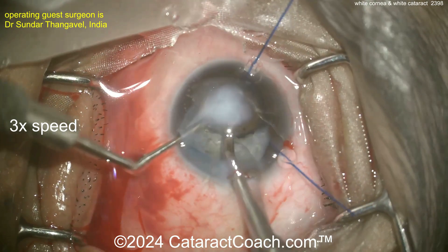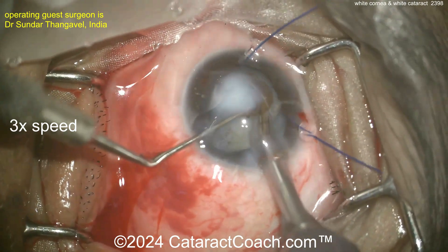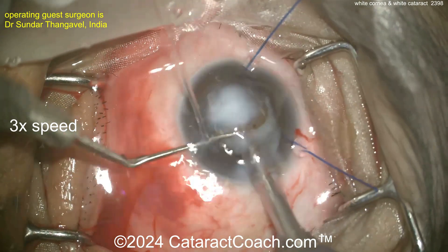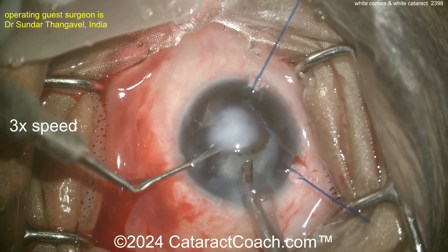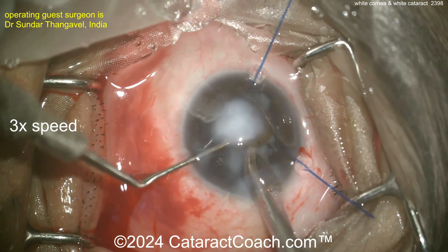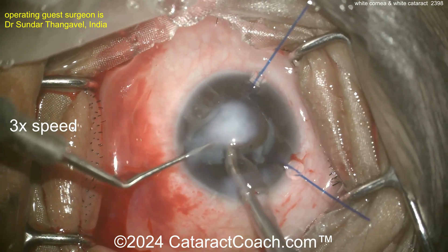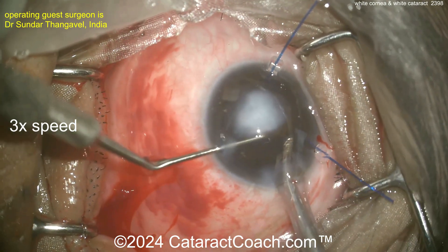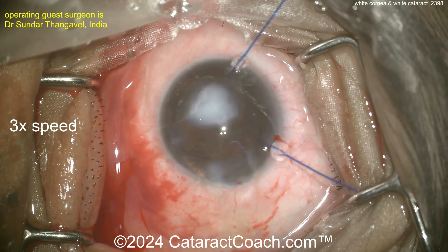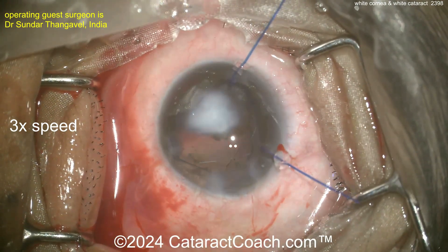Clearly this is an experienced surgeon. Removing all that cataract — there it goes. Let there be some light on that retina finally. Taking out that cataract looks good. Be careful — don't break the bag here, you're going to have a tough time doing an anterior vitrectomy with no view. As the nucleus comes out, there it is. Chopper in the safe position — I do like that. And now look at that: there is a good red reflex.